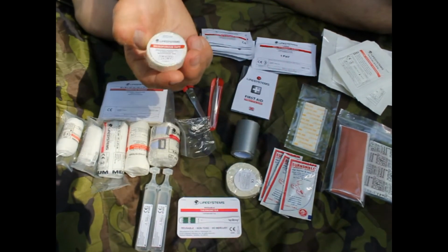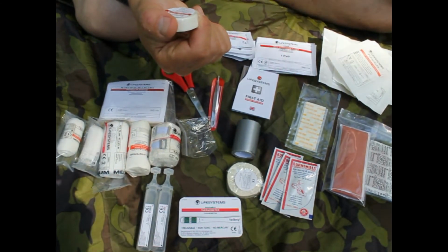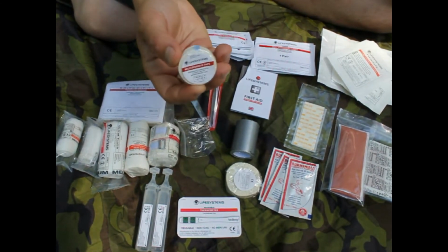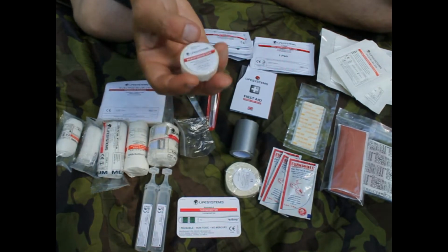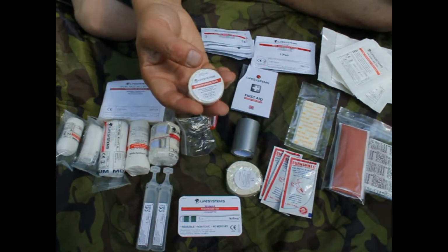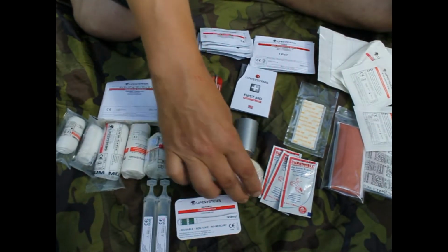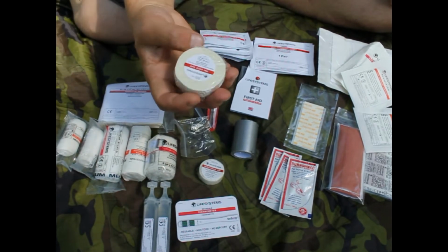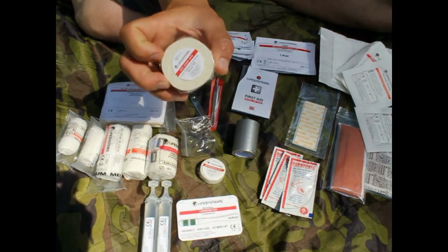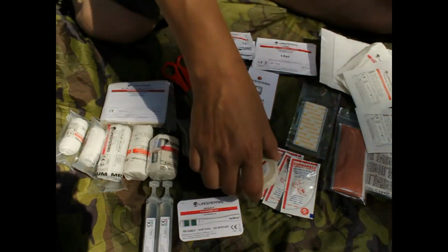We have the angel's skin here, they call it different things. This is angel tape. This is very thin tape, and it's excellent for blisters, or if you are getting blisters, this is excellent. Then you have more zinc oxide tape. This is a more heavy duty tape, also for taping up things.